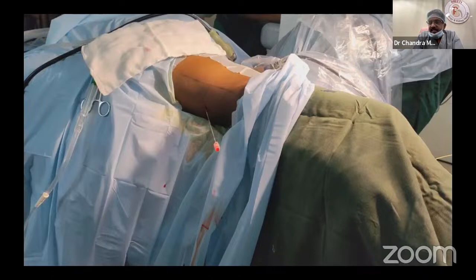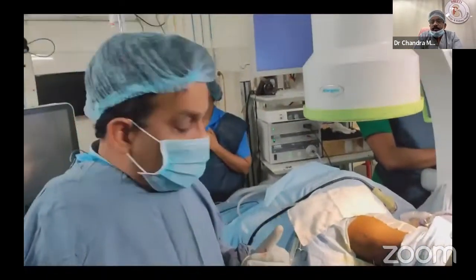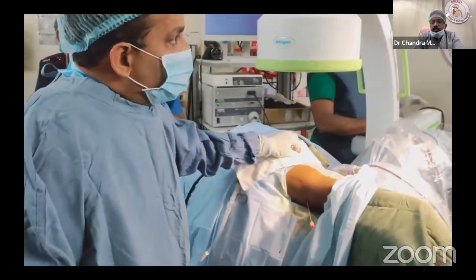In this case, it is not at all crossing the infundibulum. In children, the infundibulum length will be less, so you should be careful to keep at the periphery of the tip of the calyx. Now I will show that. That's why I proceeded. For me, it is acceptable with my experience. So everything is experience.